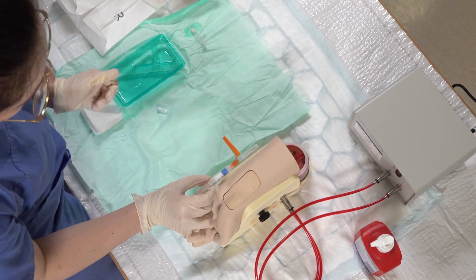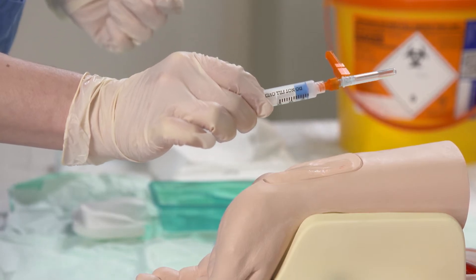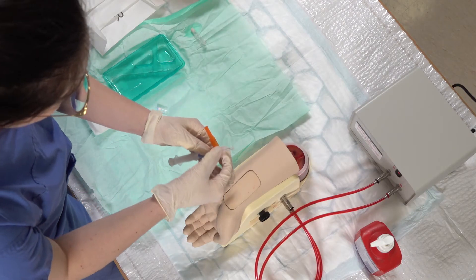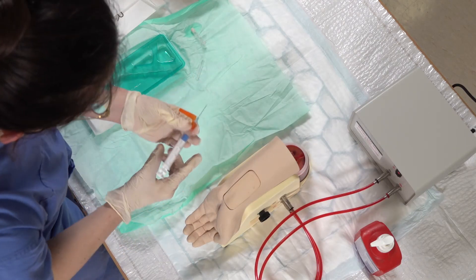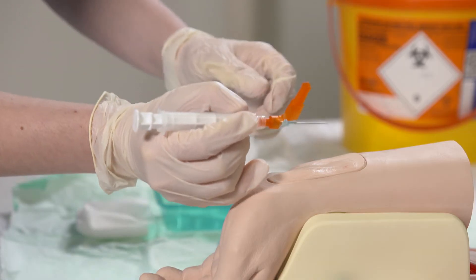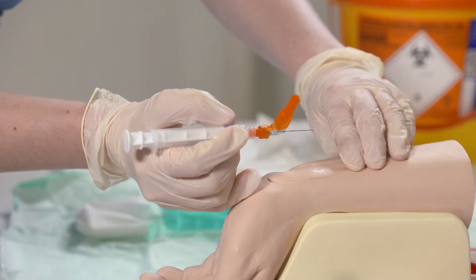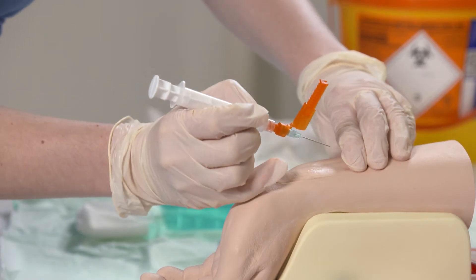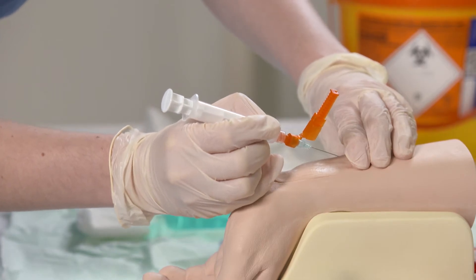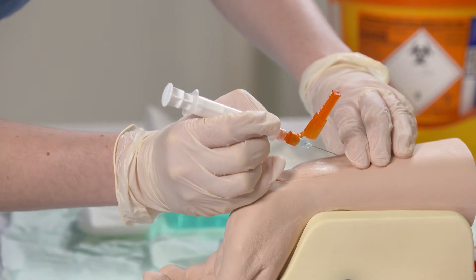The next piece of equipment is our gas syringe. It's a self-filling, heparinised needle and syringe. Just remove the cap and then holding the syringe like a pen with the bevel up, just repalpate for my pulse. Then when I'm happy with my position, I'm going to insert the needle at a 45 degree angle to go just underneath where I'm feeling that pulse.